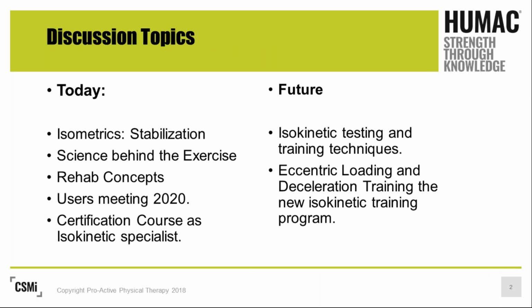So today it's about stabilization, and that helps us go through those modes of rehabilitation that we talked about. We want to talk about mobility, which we equate to passive. We want to talk about stability, which is great for isometric. We want to talk about strength, which is isokinetics, and we want to talk about control with isotonics and why each one of those fits those modes.